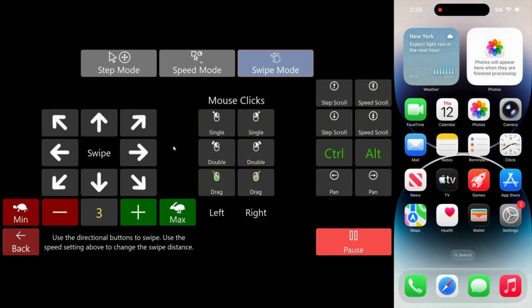On many devices, especially iOS, we cannot tell the exact position of the cursor when clicking these arrow buttons. All we know is the cursor moves in the chosen direction, then moves back in the opposite way. So if you swipe and hit the edge of the device, the cursor may overshoot and return further than its starting point. Now let's see this in action.